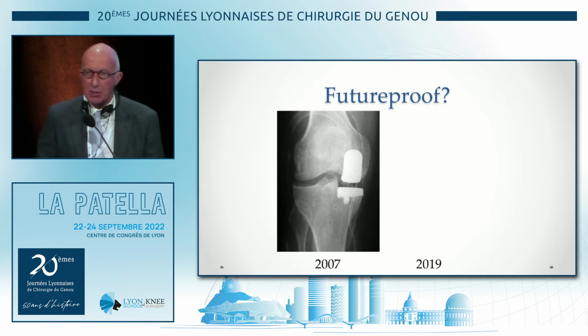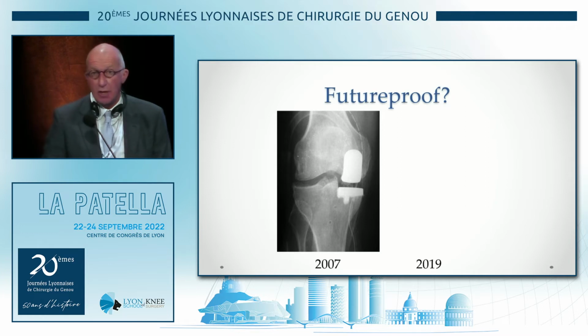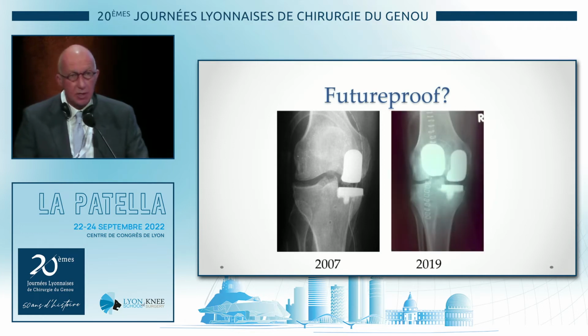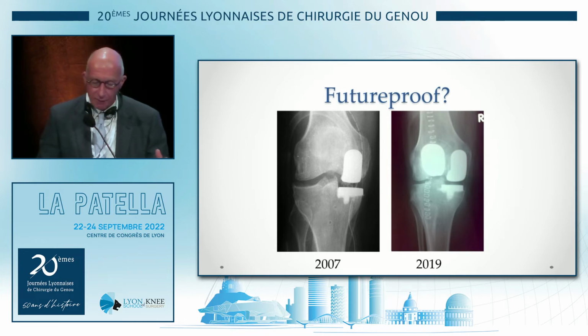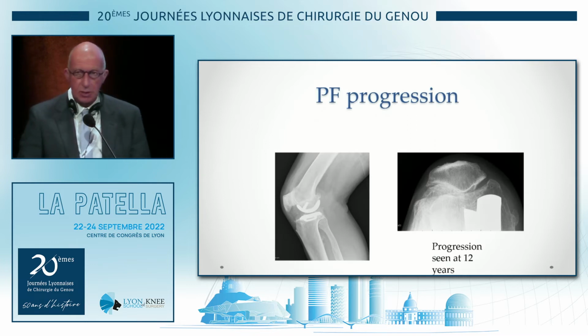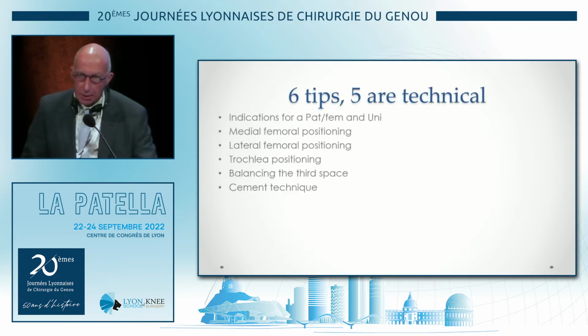Here the patient has had a uni in 2007, so the other indication for bicompartmental is progression. So you still keep the cruciates, you still keep a functional knee, even 12 years later. And that happens for mobile bearings as well. You see this progression later on. You can deal with it with a bicompartmental knee.